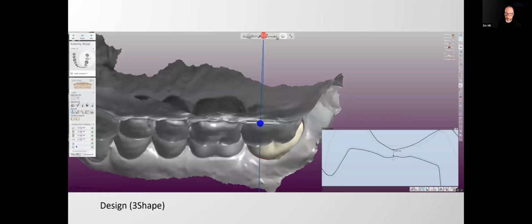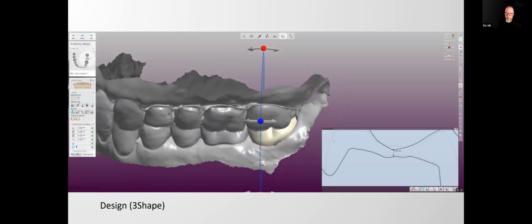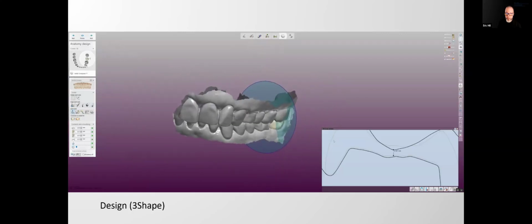As you can see on the bottom right, they're using a tool to measure that. They only have 3.5 tenths of a millimeter, so they won't be able to complete this. So this will get all the way through to the design portion. And then they'll have to call in the case, so you might lose a couple days there. So making sure you have enough room with the tools that they have on the software end on your side will make sure that you're not wasting time there too.